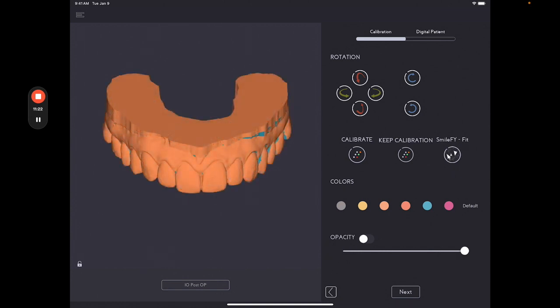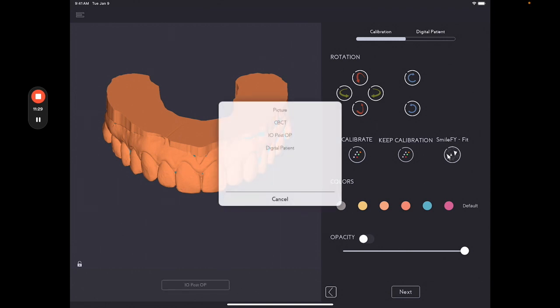Now, if you want to merge the CT scan as well, simply click in the button here at the bottom. And then look for CT scan. And you will do the same procedure.